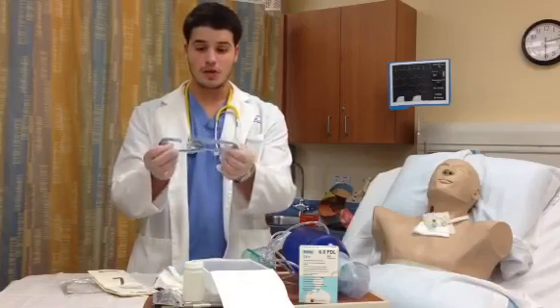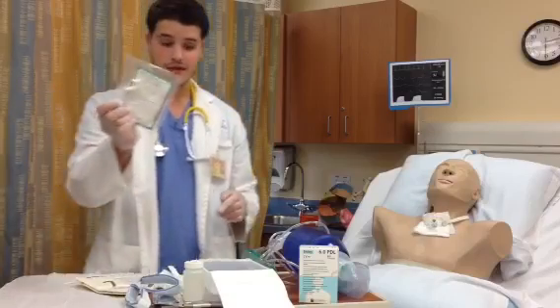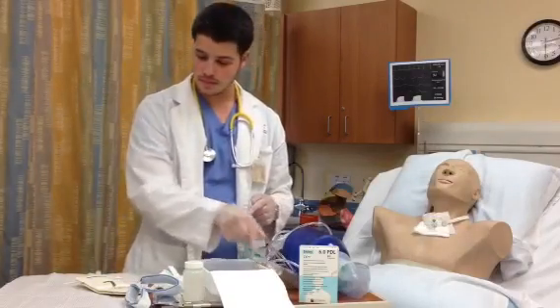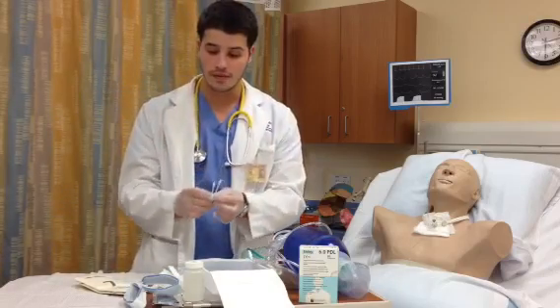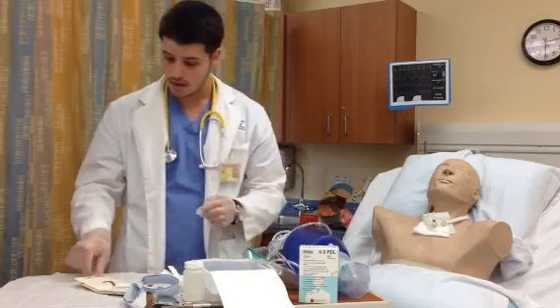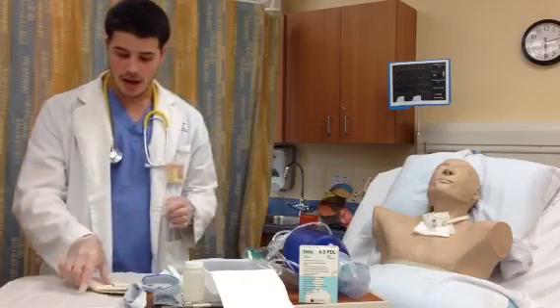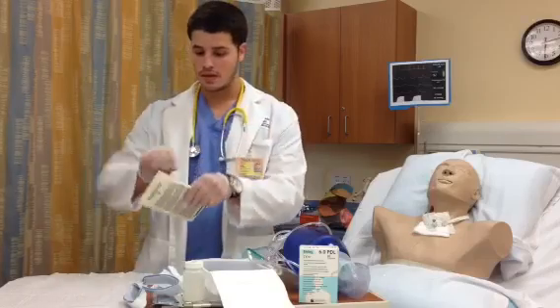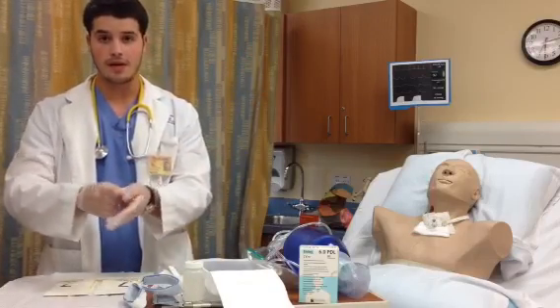the tracheostomy tube tie, a suction catheter for suctioning, cotton swabs to get in crevices that you couldn't reach with the gauzes, a brush, and your sterile gloves. You could put these gloves on over your gloves, or you could take them off and then put them on.